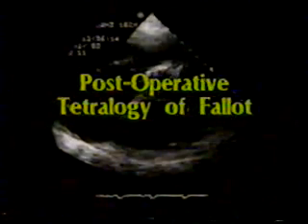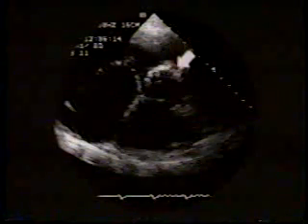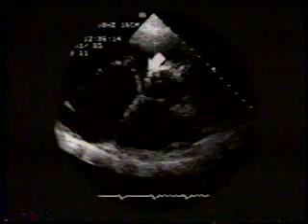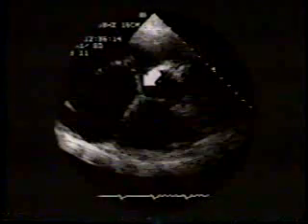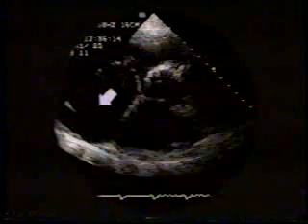This is parasternal short axis view of a 62-year-old patient who has had complete repair of tetralogy of Fallot. This patient presented now in congestive heart failure. In this view, you can clearly see this bright echo from the septal patch. It appeared intact except in its lowermost portion here where dropout is visualized. Note also that the right atrium in this patient is quite markedly dilated.